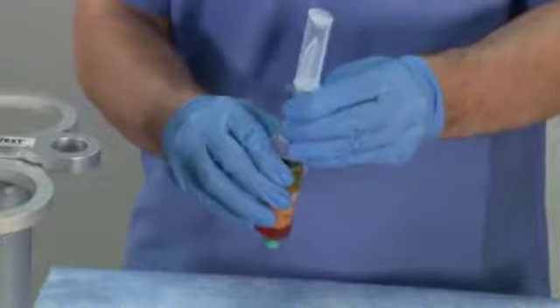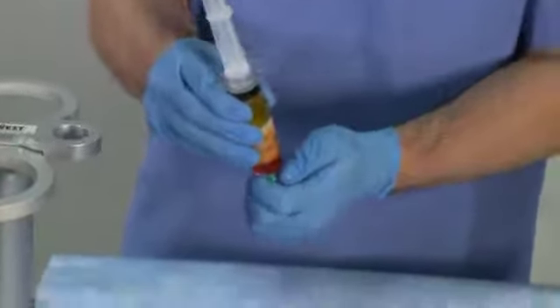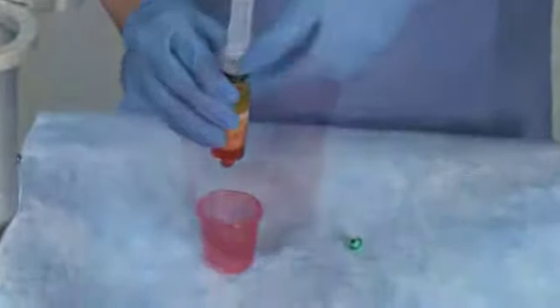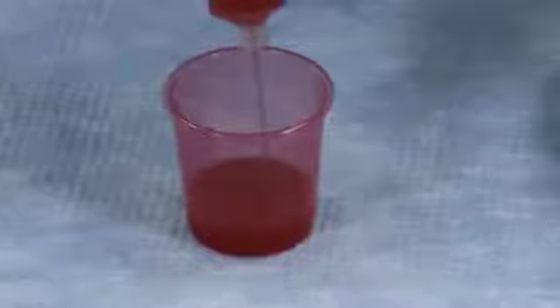Reattach the syringe handle and remove the green tip cap. Expel the infranatant fluid into a disposable cup until the concentrated adipose tissue layer is reached. Be careful not to expel the concentrated adipose tissue out of the syringe.